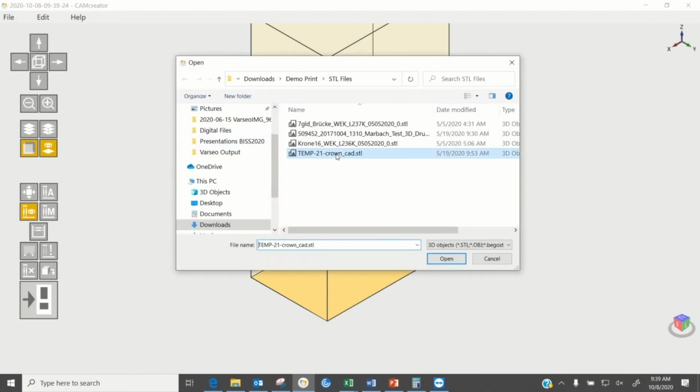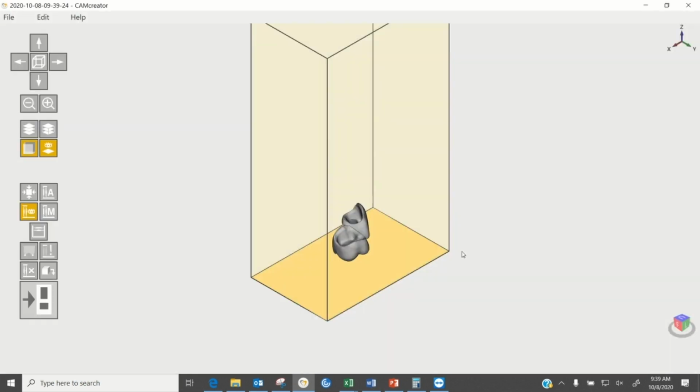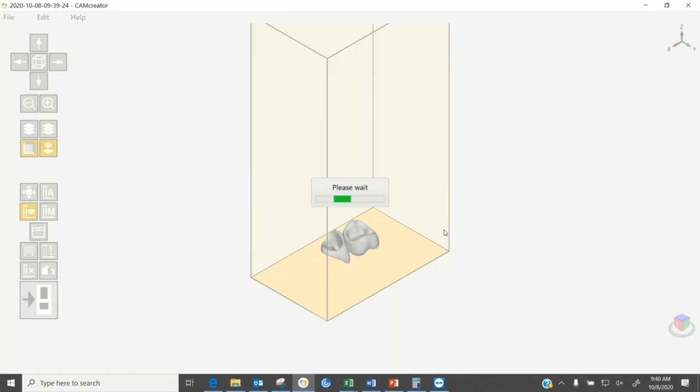We're going to load some objects. Here we're going to load a posterior and an anterior unit. And with just a couple of units, the CAM software does a good job with arranging them, but you can always have it finalize the arrangement as well. So just move them around a little bit.